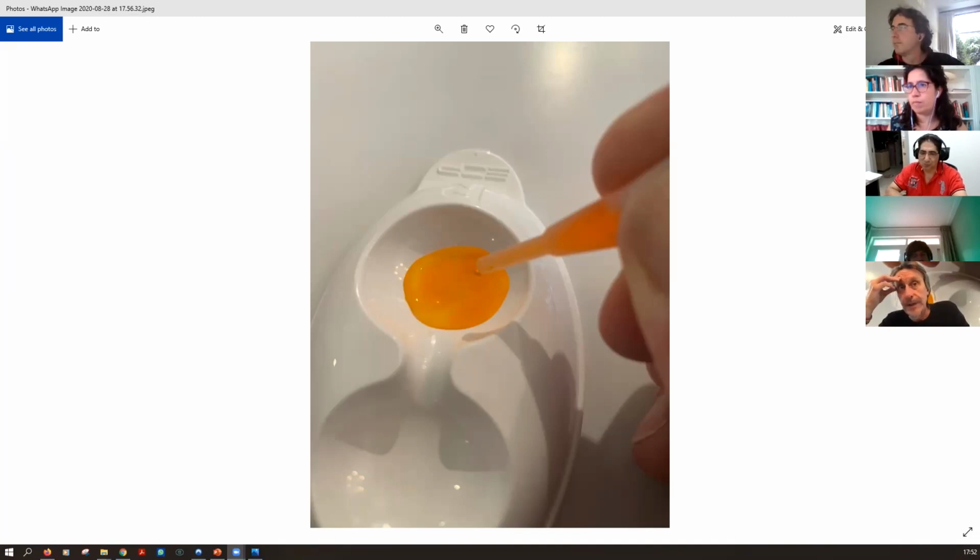Renier then said about using anesthetic, which has its advantages and disadvantages, but we found that if we use a minim, I've just had to look it up, I think a US and a UK minim is actually 60 microliters. All of our anesthetic, cyclopentolate, and other drugs are produced in the UK. I thought it was universal, but it seems it's not so. The little tiny ampule is a minim from Bausch & Lomb. If it holds 60 microliters, we use a fluorescein sodium minim, which I think is 2% off the top of my head. We use proxymetacaine or any other anesthetic that is used in whichever country will do. And for consistency, we tend to use a Vvisol product called OcuDry, which is 0.3 hyaluronic acid.